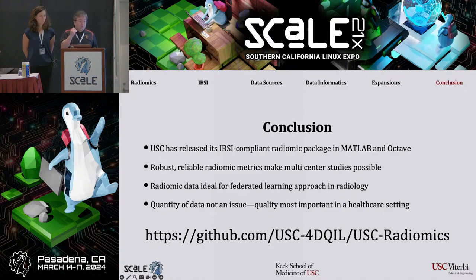Now, one of the bigger problems is how images are reconstructed, the resolution issue that you're talking about, because images are reconstructed specifically just for the viewing convenience of the radiologist. So higher resolution images, if you're reconstructing from the raw data, aren't stored. There are many theories on that, but one of the issues is if you have data that can be reconstructed at a thinner slice, and later somebody sues you and you reconstruct that image, they can say, oh well, you can reconstruct that image, why didn't you reconstruct it at a thinner slice and catch it? There's a bunch of medical legal issues with that.